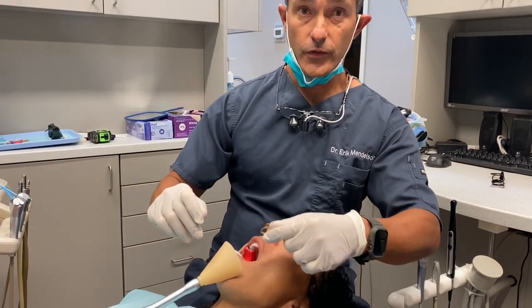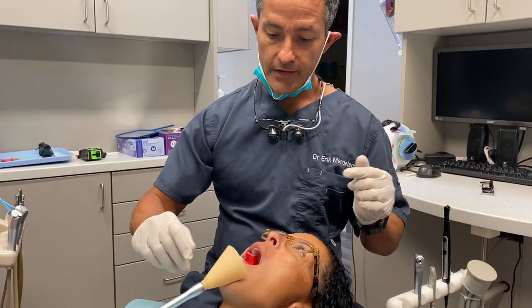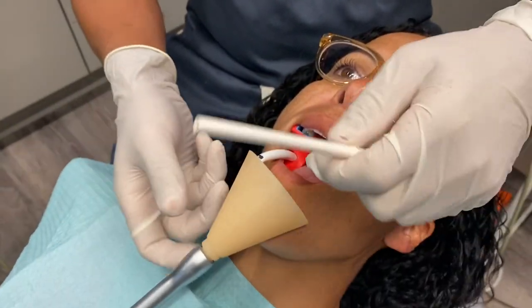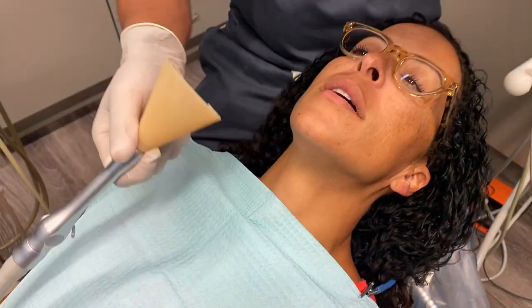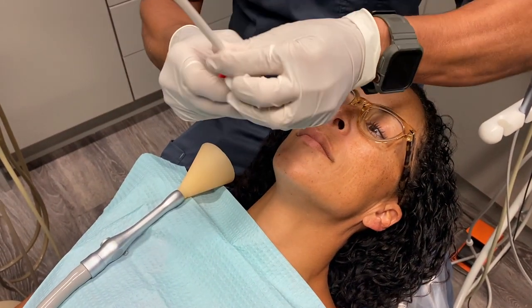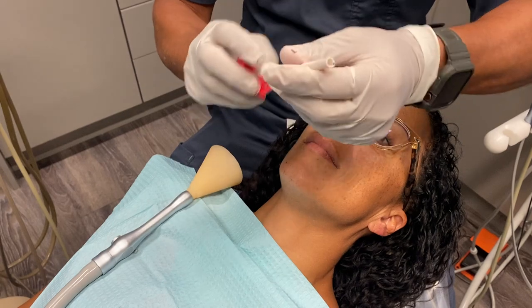If we want to be further away instead of the five inch, we can always just use a standard. Open. This is just a standard non-cut.